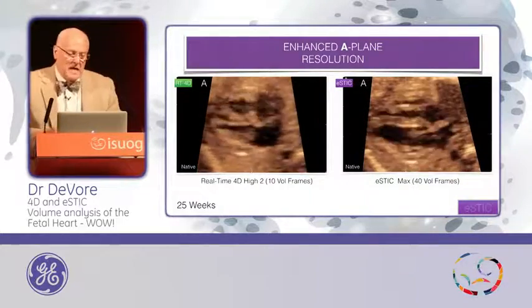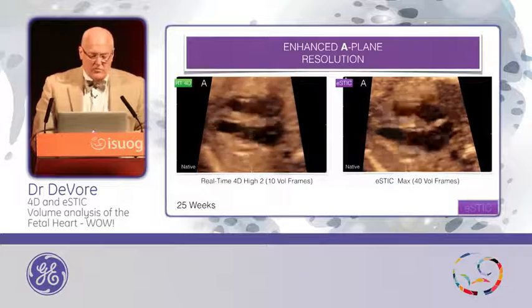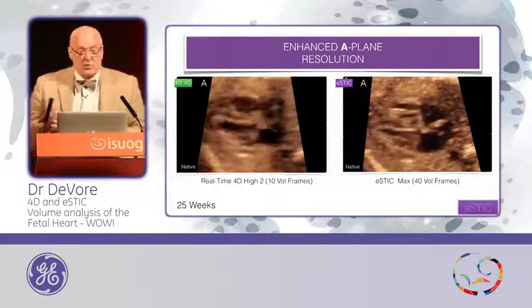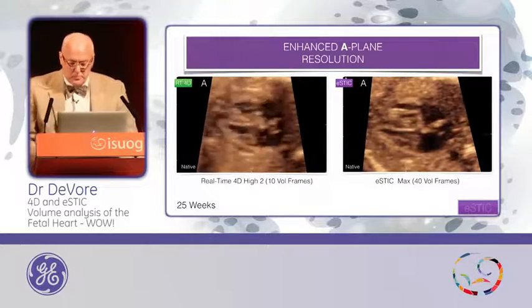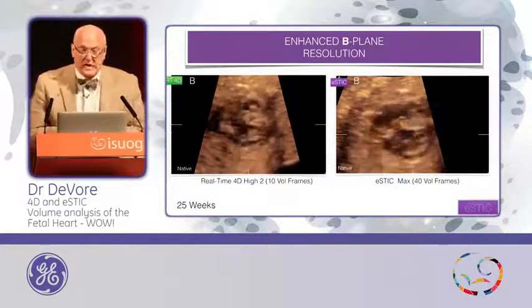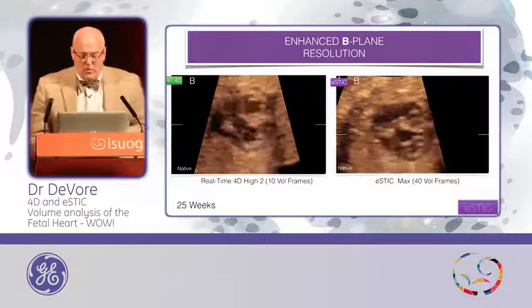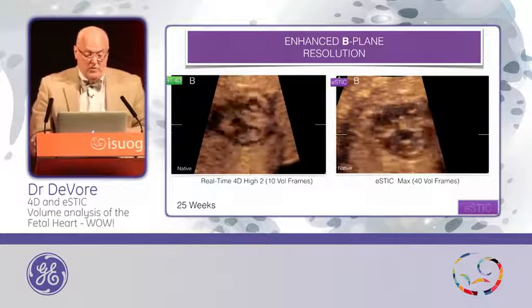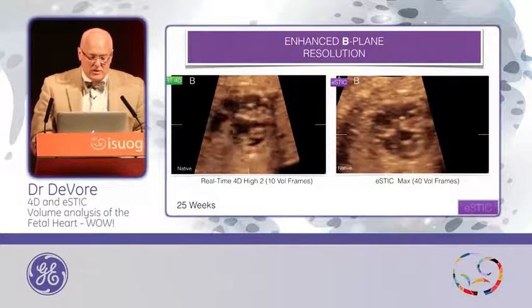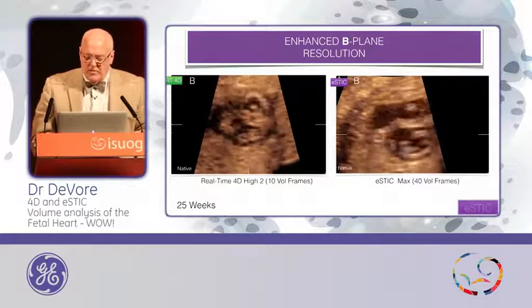If we compare the resolution in the A, B, and C planes — on the left, we have the real-time 4D from the same fetus at 25 weeks of gestation. It looks very nice, but the image on the right with the E-STIC has a little bit higher resolution. If we look at the B plane, which has been a disaster most of the time with traditional STIC — I always seem to get artifact unless I spend 35 minutes trying to get a perfect acquisition — with E-STIC and real-time 4D, that's virtually eliminated. Look at the details of the anatomy: we see the fish mouth of the mitral valve, the tricuspid valve, the pulmonary valve, very nicely demonstrated.